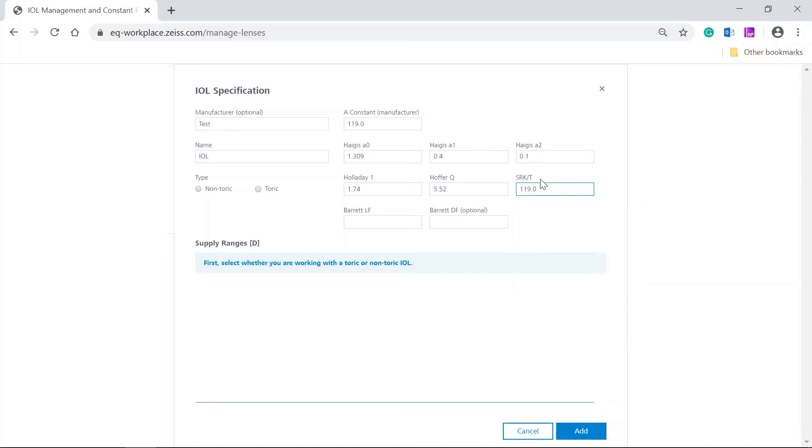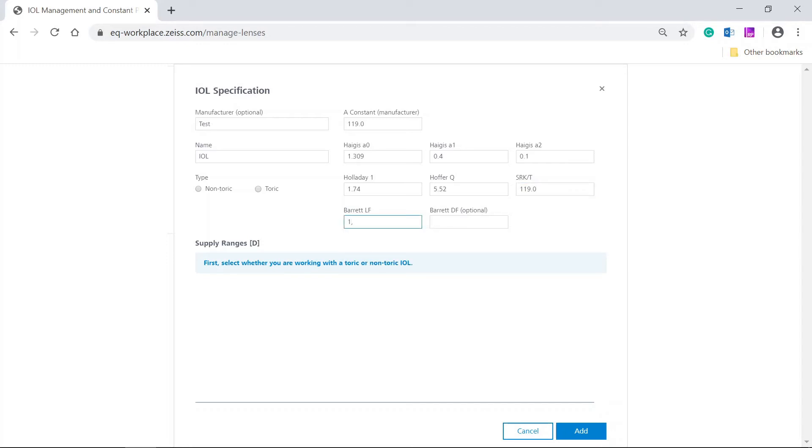Here, we leave the Barrett DF field empty. And finally, Barrett LF 1.88.